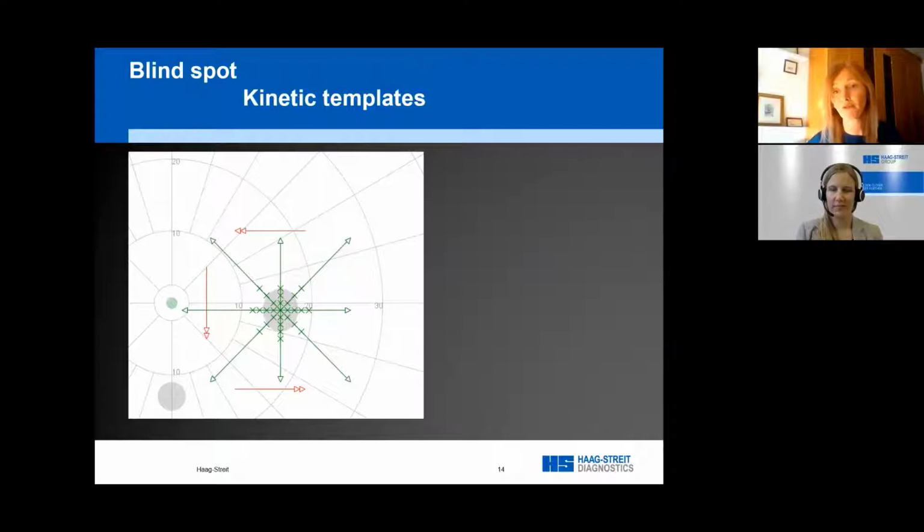And the same with reaction time vectors that you would put in for other parts of the visual field as well. But knowing whether the patient has a very long reaction time or a normal reaction time is quite important, and does affect the size of the visual field defect or area that you get. And it's another means of getting more consistency into the results, right?